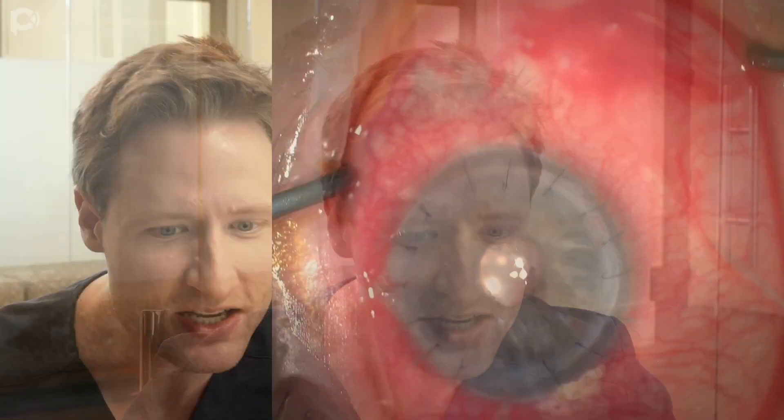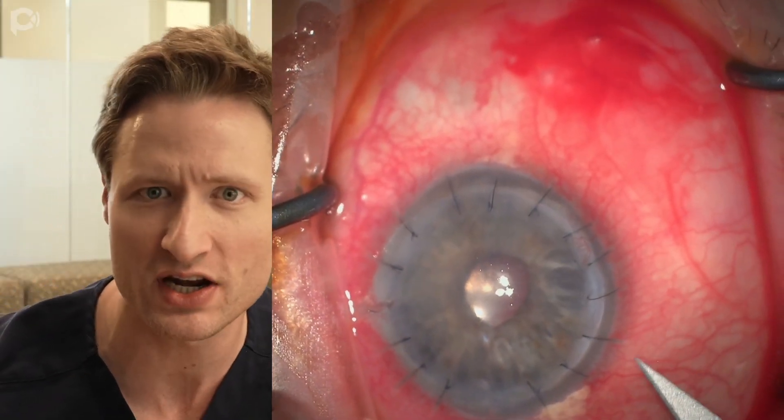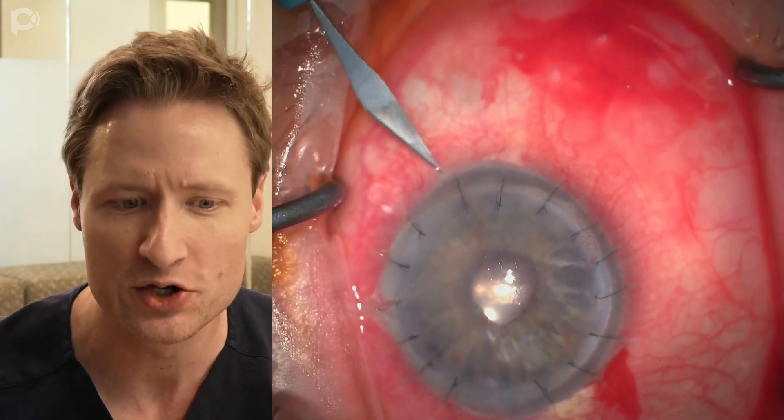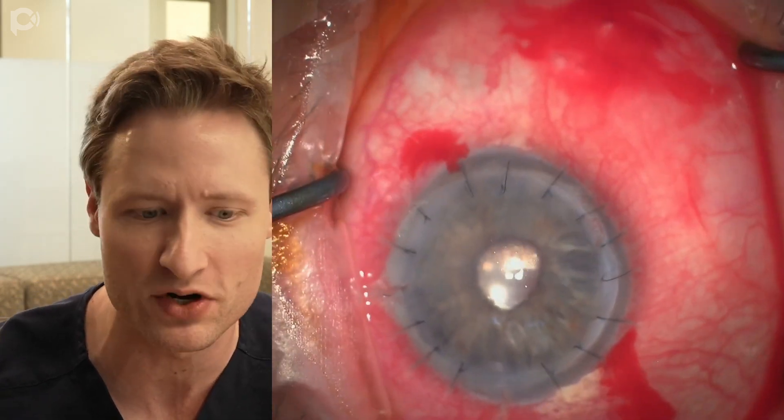In fact, DMEK is usually easier in an eye that's had a previous PK than it is in a normal eye operated on for, say, Fuchs dystrophy — as long as you know a few techniques and tricks to make the operation simpler. This is an eye that we operated on just in our office last week, and I want to show you the full unedited video to reveal those tricks.